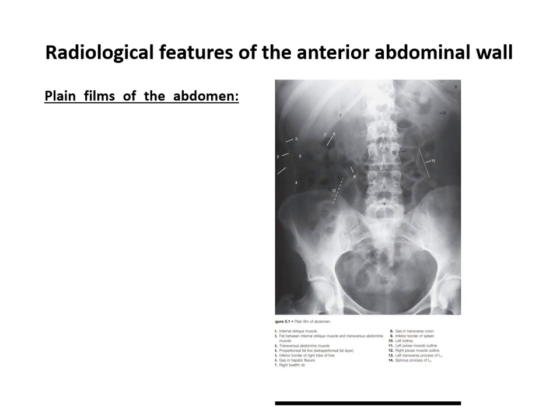The radiological features of the anterior abdominal wall on the plain film: laterally we can see the flat abdominal muscles. There is a lucent line — the properitoneal line. When we see this fat line, it indicates there is no edema, although it's not seen in 80% of normal individuals. This shadow represents the psoas muscle — the right psoas and the left psoas. Also visible are the inferior margin of the spleen, the left kidney, the ribs, and the gas pattern of the large bowel.